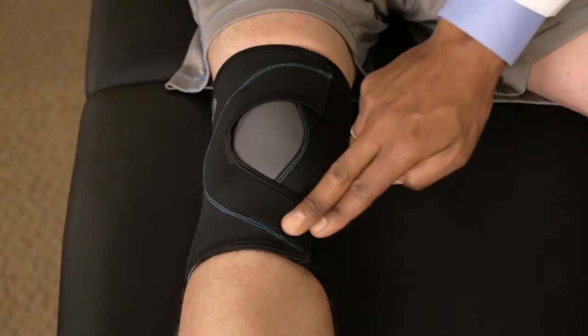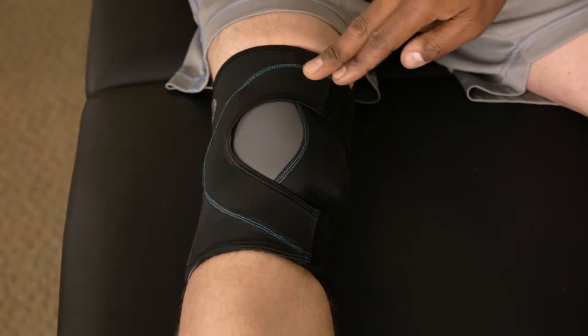The black fabric enables moderate compression — ensure it is around the knee joint for support. Now you're ready to enjoy the comfort of the FreeSport.